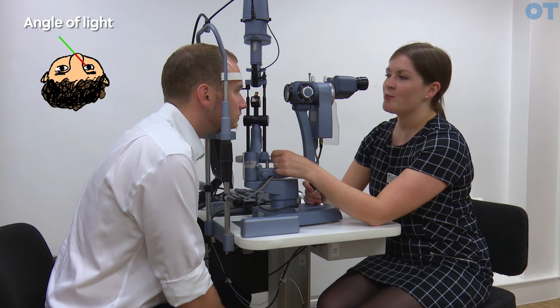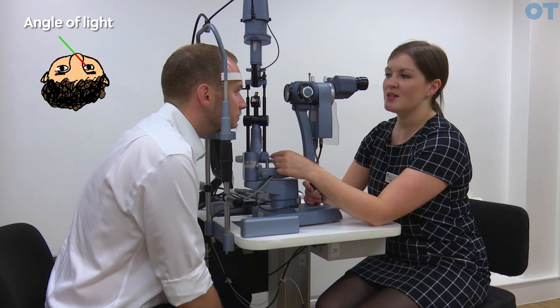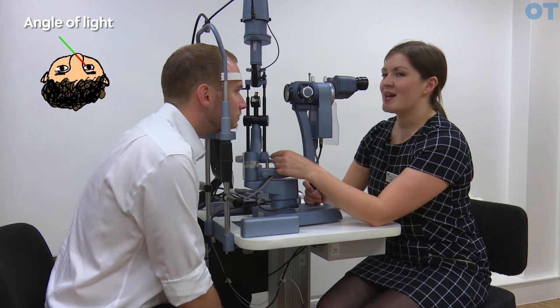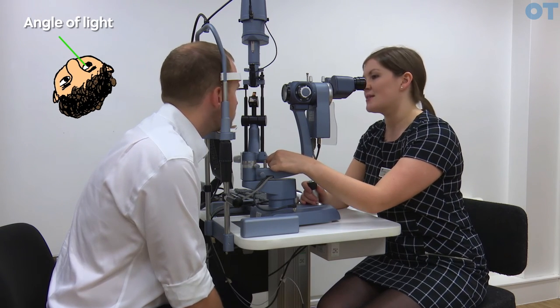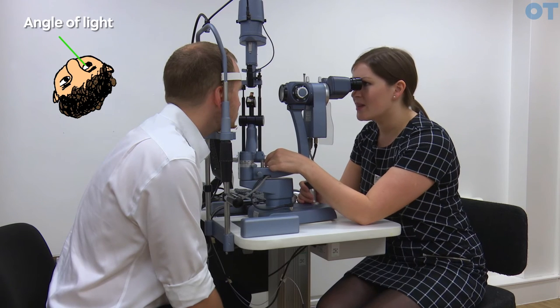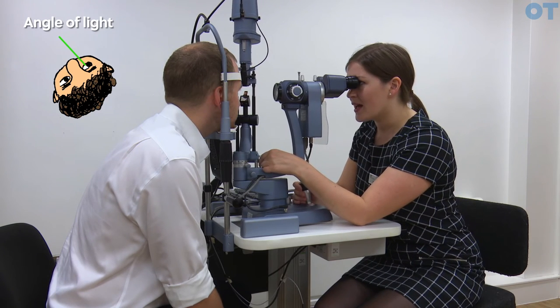If you are aware that your patient's nose is obstructing the illumination system, you are able to ask your patient to rotate their head round while still looking straight ahead, and again placing the beam at the limbus.